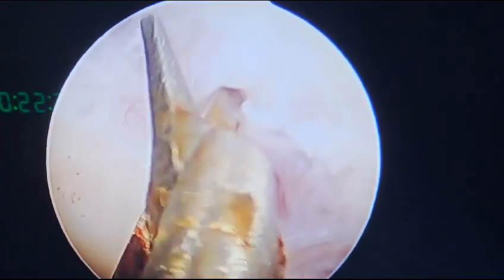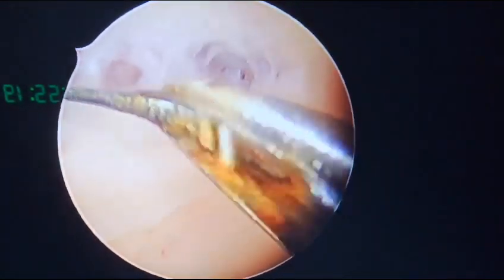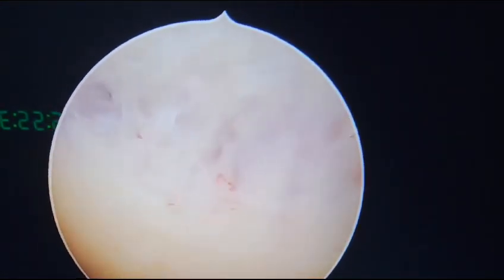Once you cut, the endometrium recedes, the myometrium recedes. Recession of myometrium occurs. So there are 3-4 things to be noted. Important are both hysteroscopic as well as laparoscopic findings. If both hysteroscopic and laparoscopic findings show that she has genital tuberculosis, then we'll put her directly on ATT without waiting for the report. We can see clearly, beautifully, the myometrial vasculature.